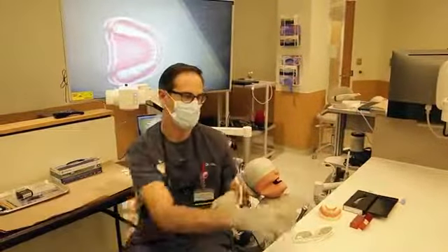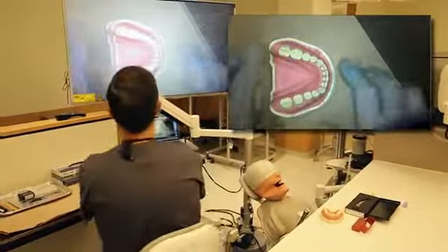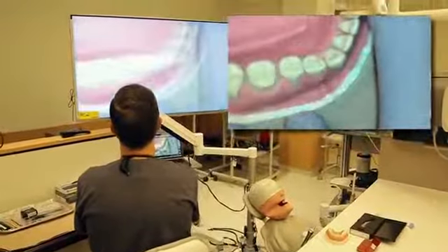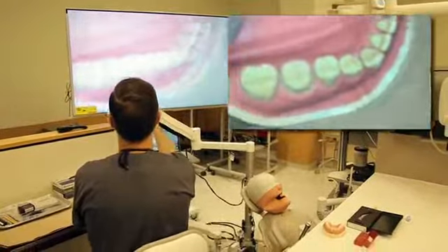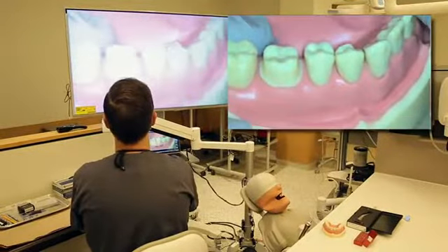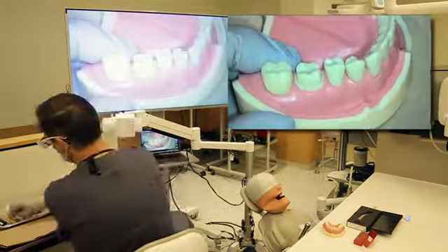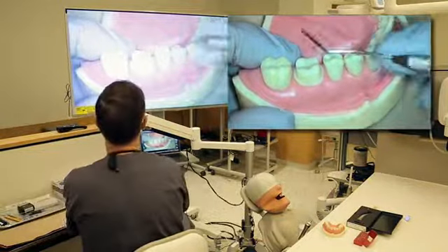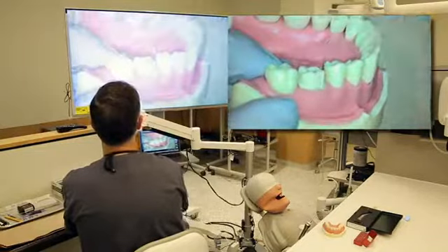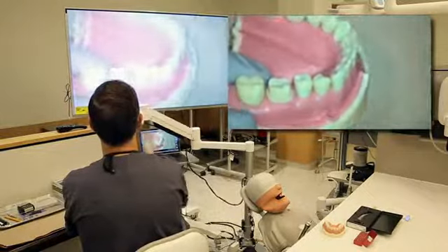using our 3D camera is that with the 3D capable glasses, we are able to see this together simultaneously, and we're able to evaluate the work together as well. So it becomes a really nice tool when I want to show a student what I'm working on or what they need to improve on. We can actually look at this together in a 3D camera and see where some of those improvements need to be made in the preparation.